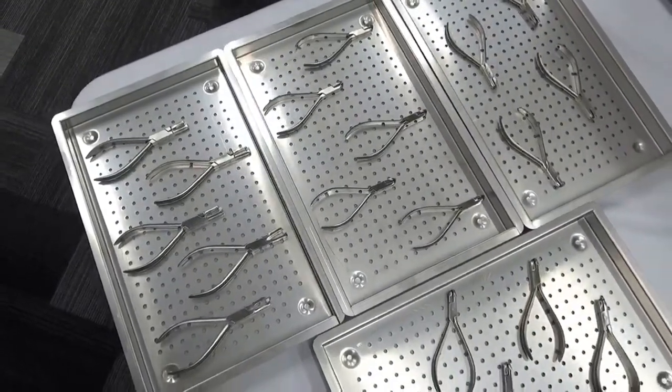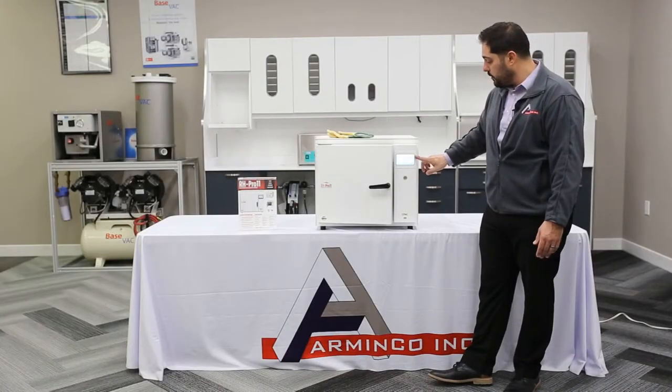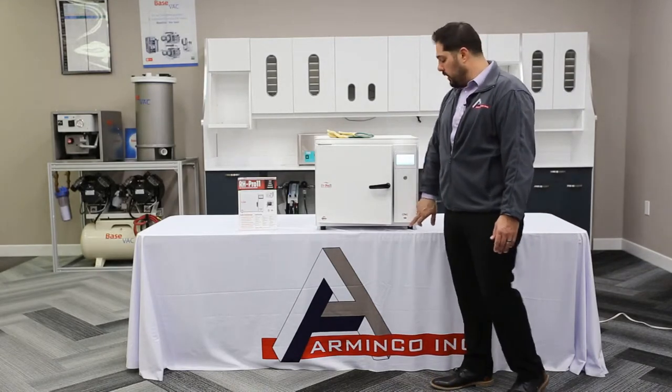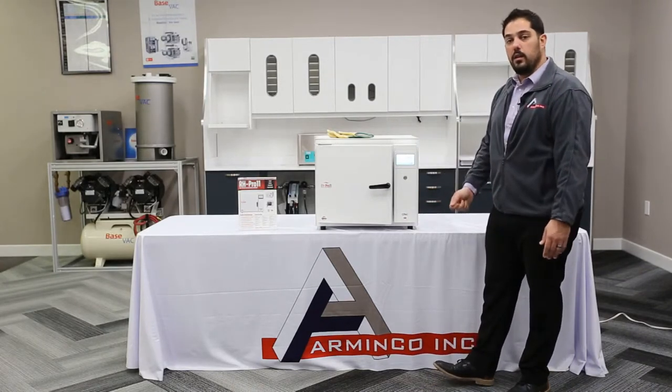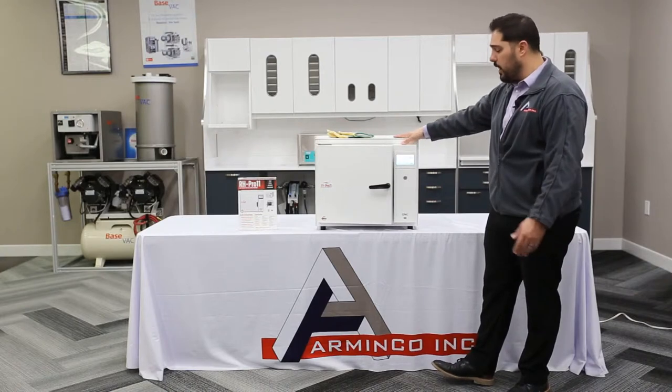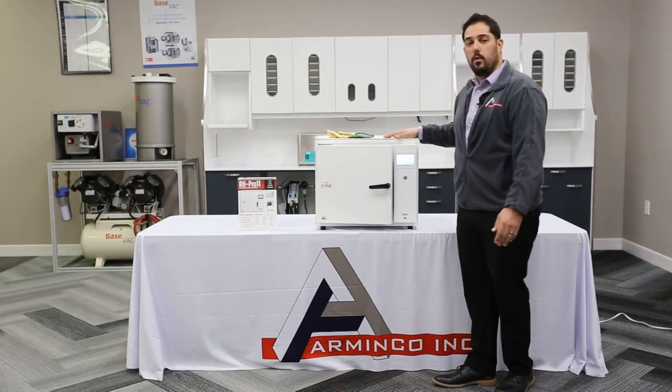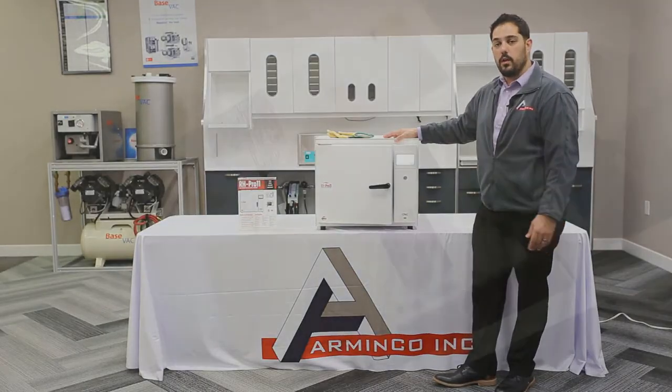The front display is very simple and easy — just a power button, your touch screen display, and a USB thumb drive port so you can take out any data you need from the unit. If you have any questions, please feel free to give us a call — we're more than happy to help. My name is Henry and I am with Arminco Inc.